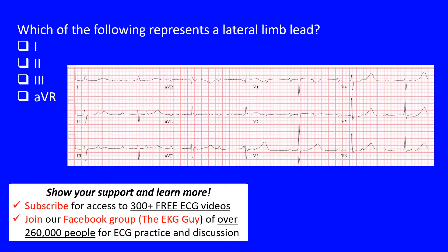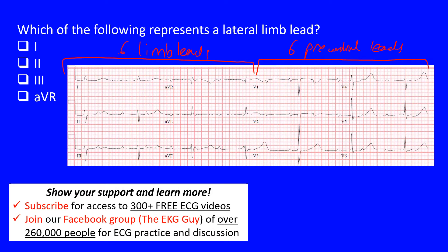We have a 12-lead ECG — no rhythm strip here, just the 12 leads. On the left side we have our limb leads, and on the right side we have the precordial leads. There are six limb leads and six precordial leads. From beginning to end of the ECG represents 10 seconds, with each lead being 2.5 seconds — so the standard ECG gives you 10 seconds in duration.